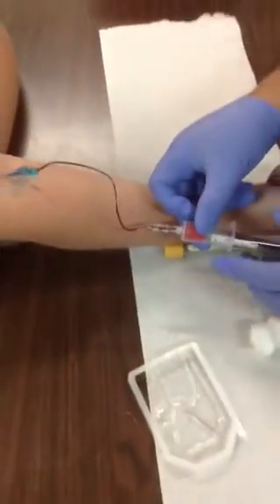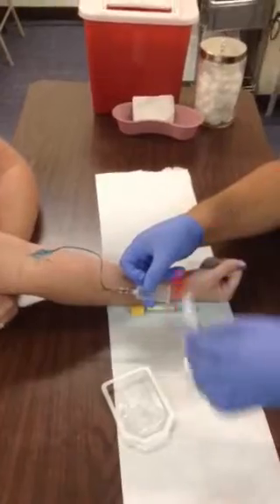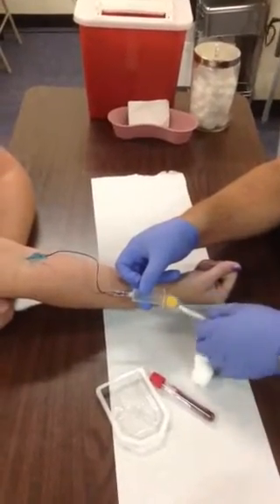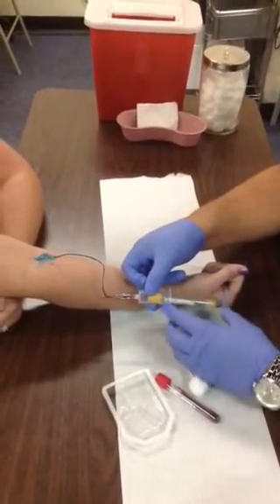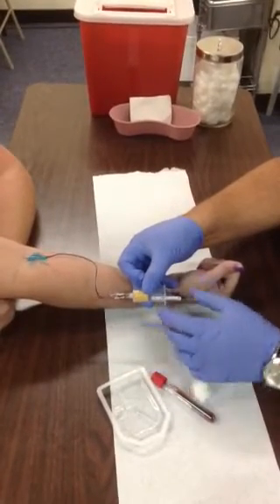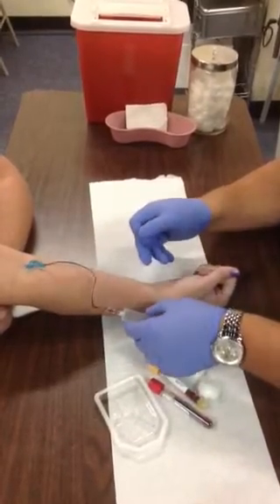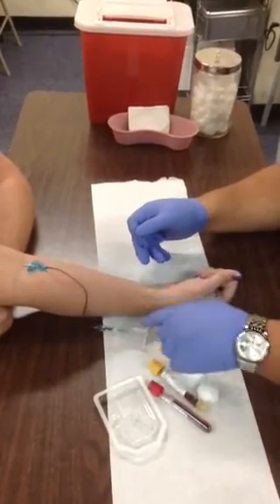Go ahead and pop your tube in. You don't have to fill it all the way up — we're going to pull one tube out. You can see that we've got blood. Take the second tube and pop it in, using the flange to steady your tube as you push the butt end of your tube in. Just a small flow of blood and we're good to go.